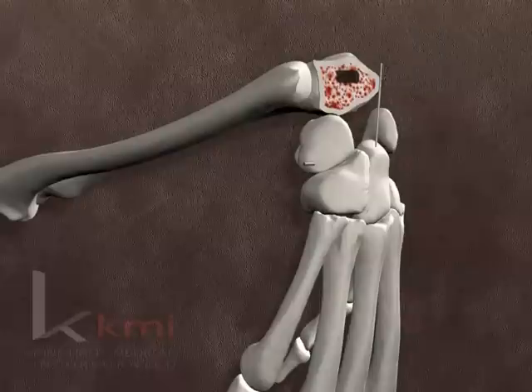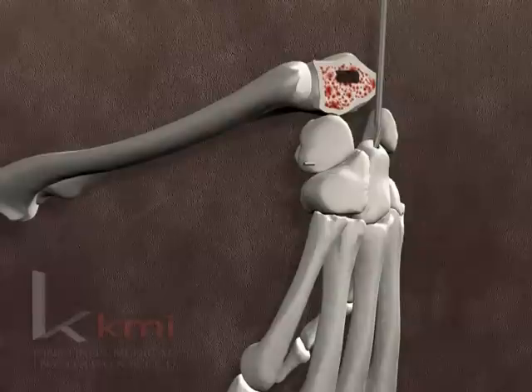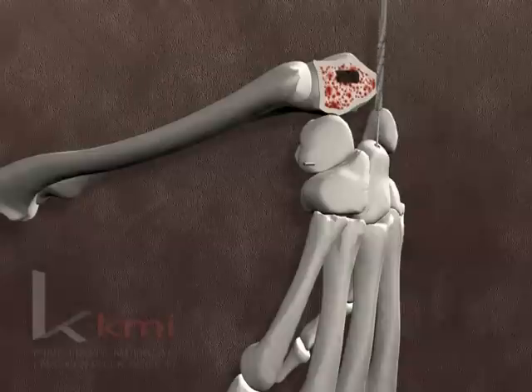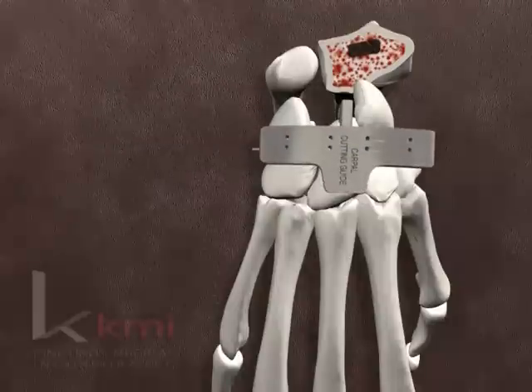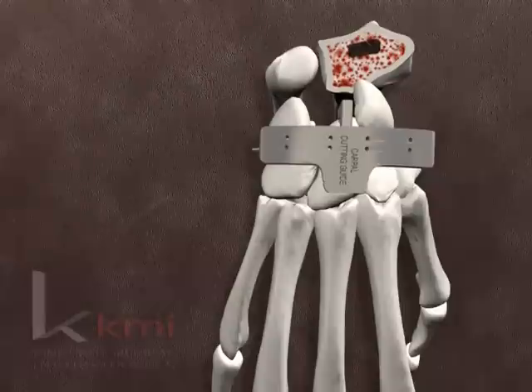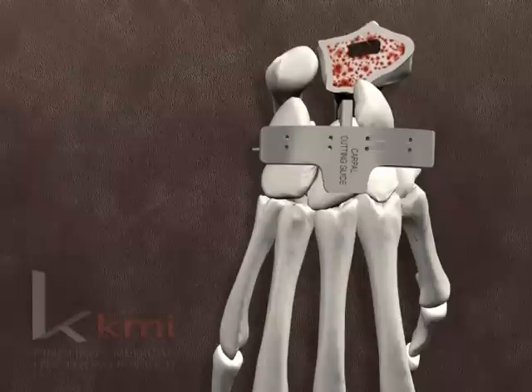The sleeve and drill guide are removed sequentially. The 3.5 mm cannulated drill for the minimal hole or the 4.5 mm cannulated drill for the standard hole is placed over the guide wire, and a hole is made in the capitate to the proper depth corresponding to the appropriate implant size. The appropriate carpal guide bar is inserted into the capitate drill hole. The carpal cutting block guide is mounted onto the guide bar and slid into proper position. It should guide the saw cut through the proximal 1 mm of the hamate, passing through the capitate head, scaphoid waist, and mid-triquetrum.